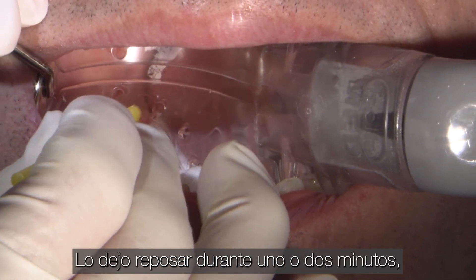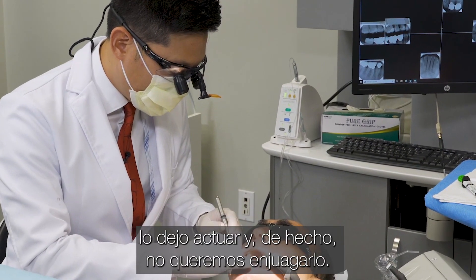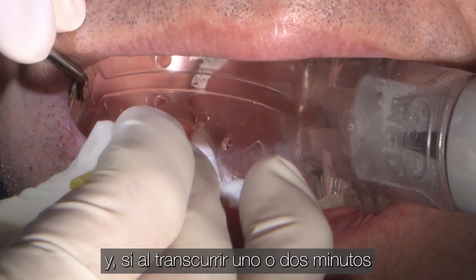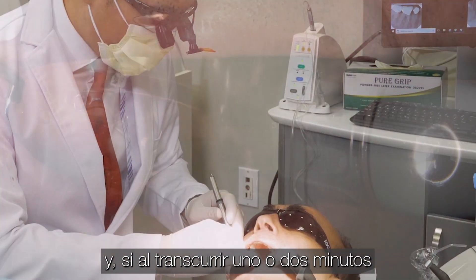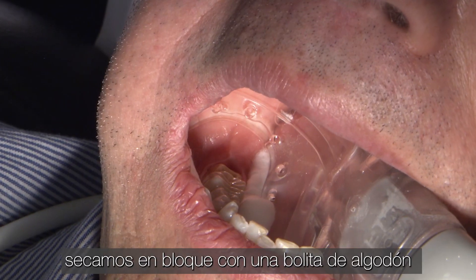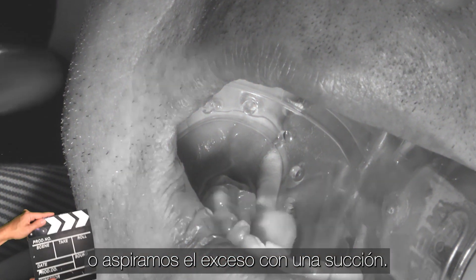I let it sit for about one to two minutes and leave it on — we actually don't want to rinse it off, I just leave it on the preparation. If after the one or two minutes have elapsed I see a lot of excess desensitizing agent, then I'll blot dry it with a cotton pellet or aspirate the excess with suction.